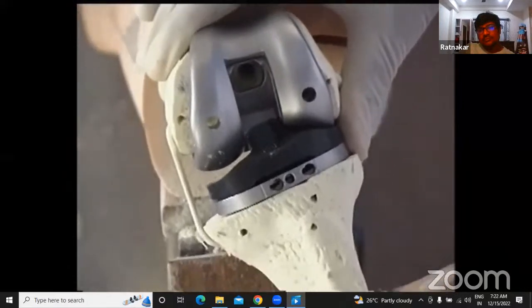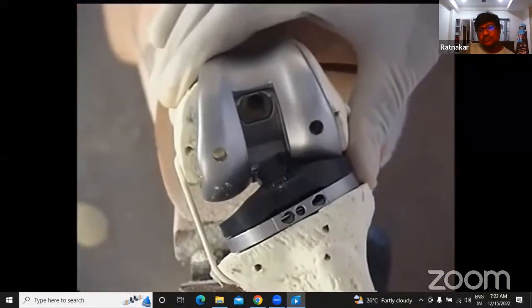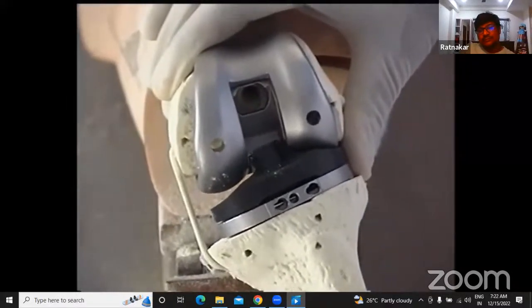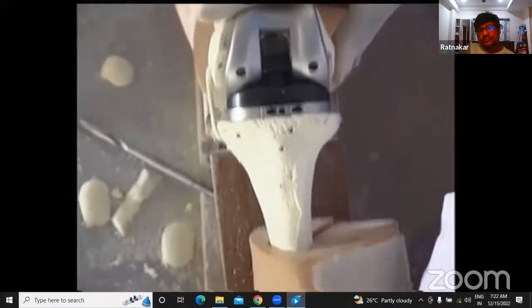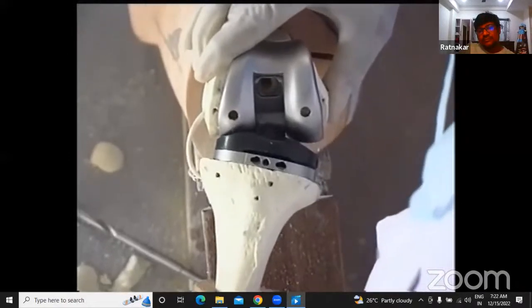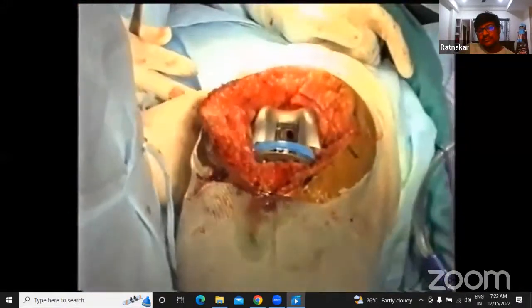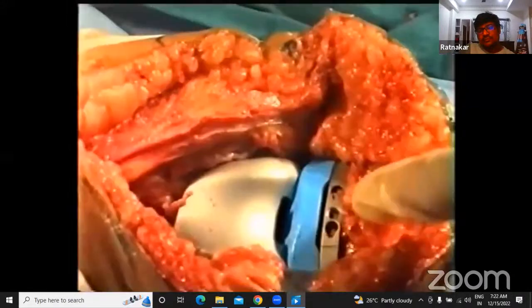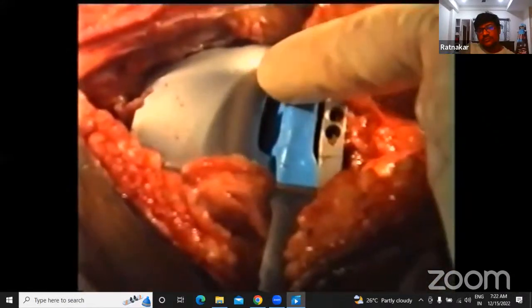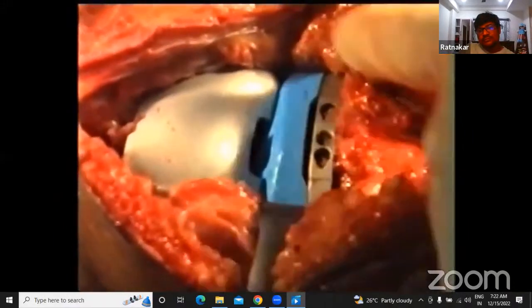If you got a knee like this when you are flexing, that means your lateral compartment is tight and you have to do a lot of soft tissue release. So ultimately, when you flex it, the tracking should be uniform like that. You should not be like that and you should not be like that. These condyles should nicely touch the femoral condyles, okay?